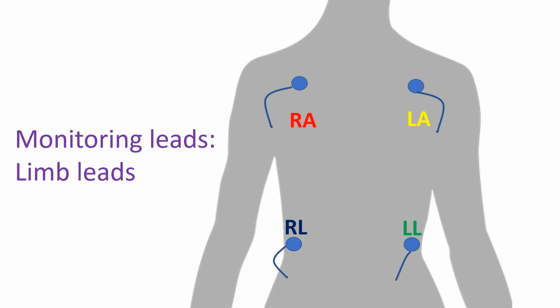While monitoring ECG in an intensive care unit, the limb electrodes are placed on the body at a point close to the origin of the limbs. This is to reduce movement artifacts in the tracing. Placing the leads on the body also prevents tethering of the person and allows free movement of the limbs. The same method is followed while recording ECG during an exercise test.